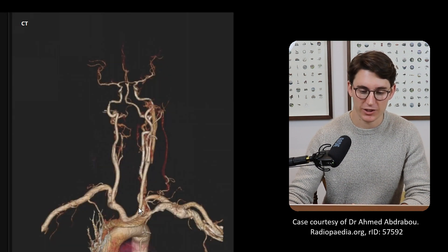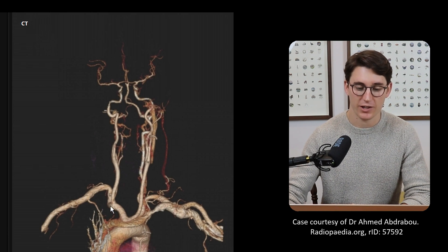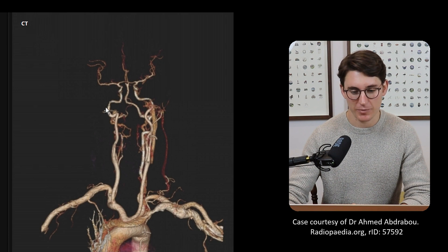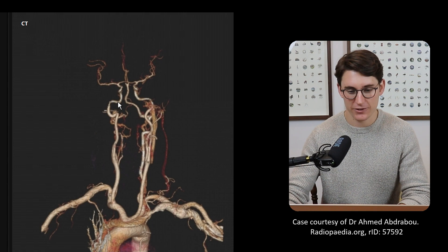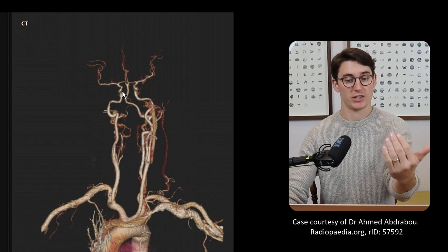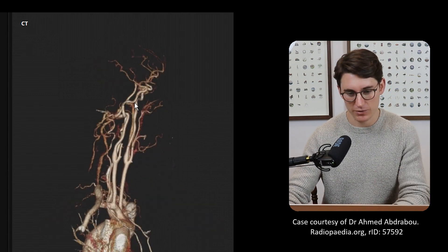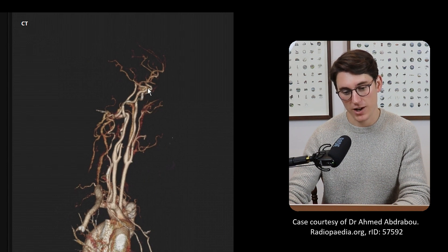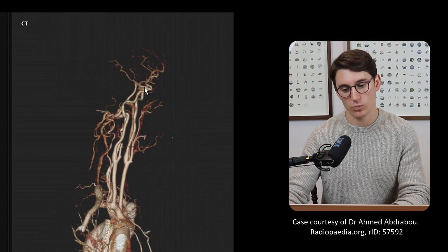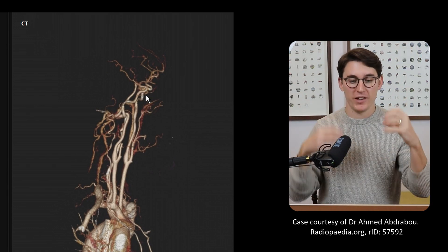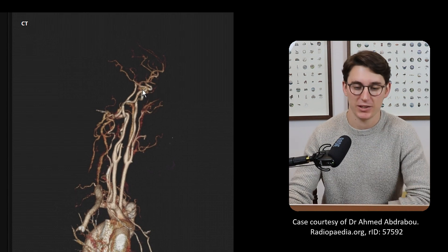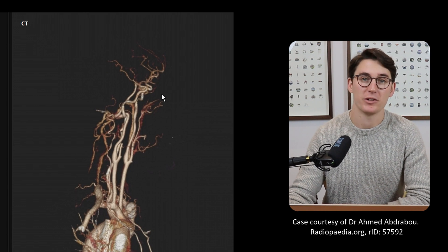Now we can do a 3D reconstruction of this. Here we can see the right-hand side of the patient — our brachiocephalic trunk, our right common carotid coming off it, then our internal carotid making its way up to the level of the carotid canal, coming anteromedially, past the foramen lacerum, up towards the level of the cavernous sinus. We can see we've come through the petrous bone, past the foramen lacerum, up towards the cavernous sinus, wrapping around past the anterior clinoids and coming over the top. Remember that loop — where we are here is next to the sella turcica, and in that middle bit is the pituitary gland, which is going to help us name some branches later. Then we come up and split into our anterior and middle cerebral arteries.